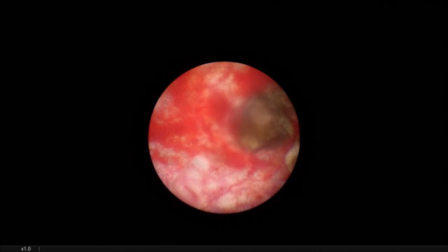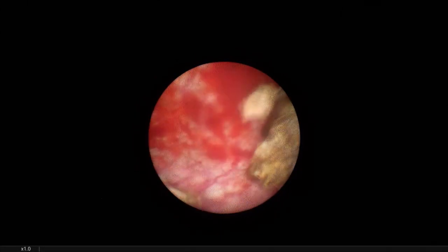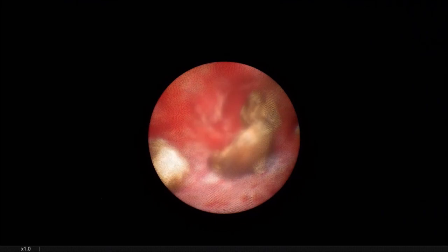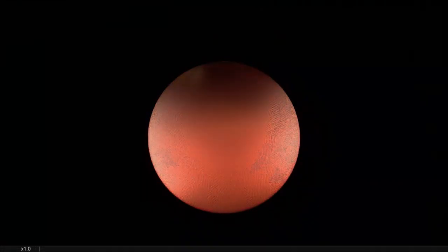You are seeing the picture from the scope. Okay, now we can move forward or pull the sheath a little. Okay, now the stone goes automatically into the Amplatz sheath. Show the camera. Mal zeigen. In die Kamera. So.